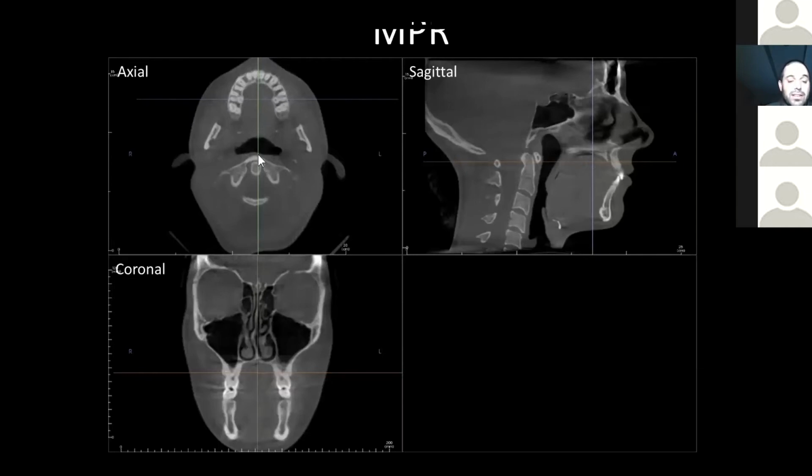And like I said earlier, most cone beam softwares and radiology softwares by convention will view the axial view as the patient from the toes up. That's not always the case. There are a couple exceptions out there. In that case, the R's and the L's would switch, which will help you out. Okay.